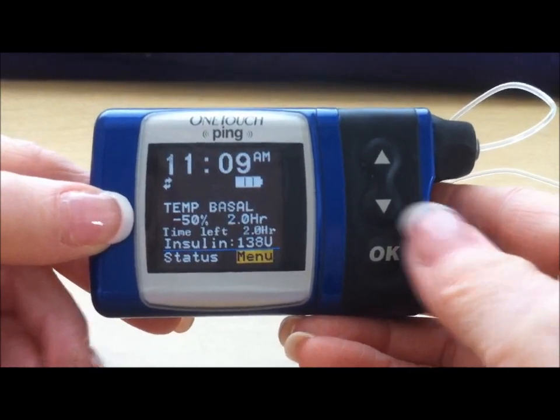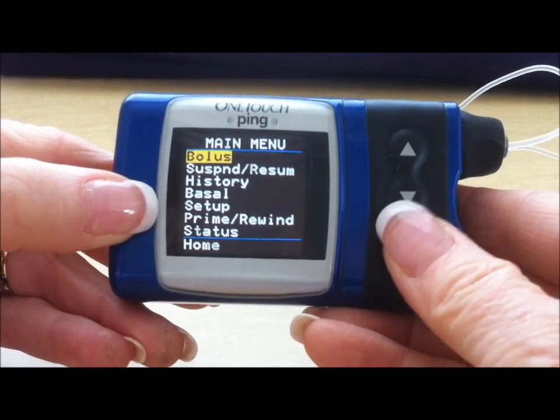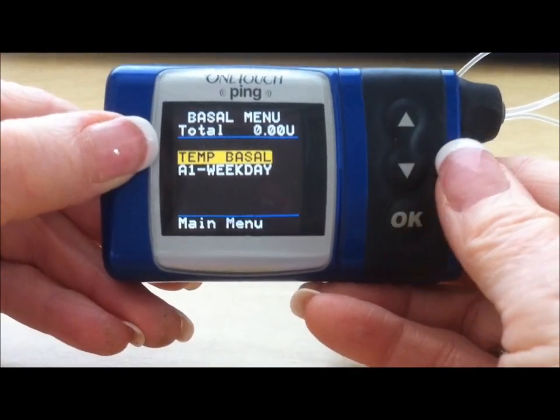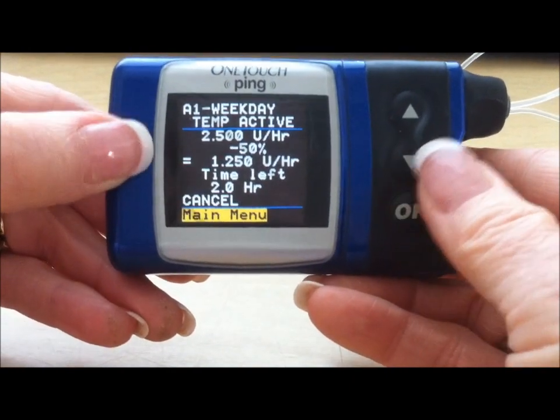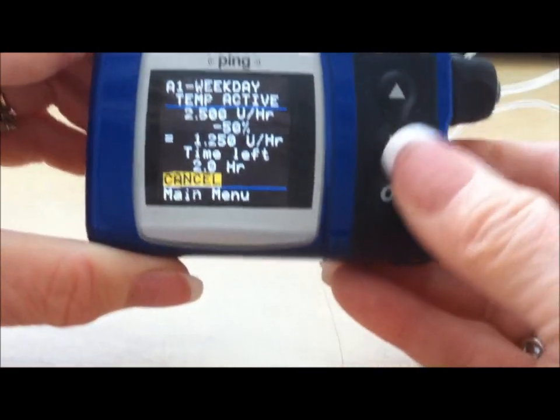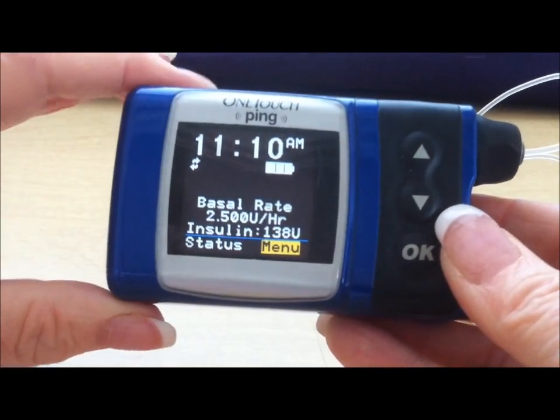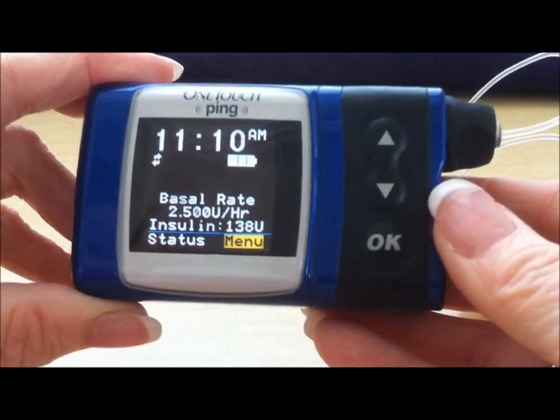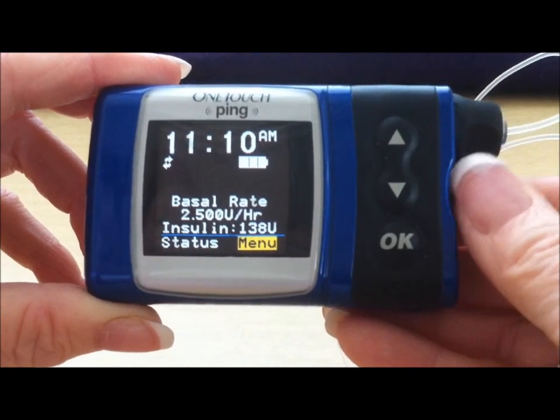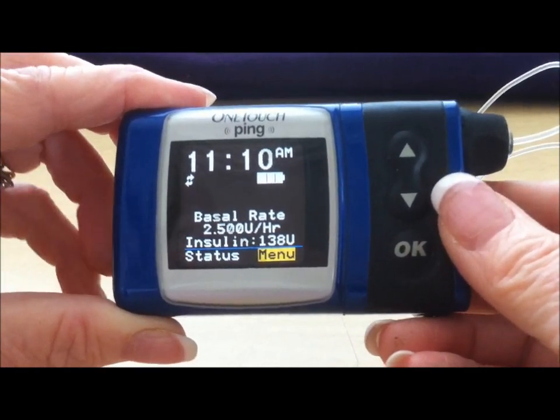If you have set a temporary basal rate for some anticipated exercise but end up not doing that, you can go ahead and cancel the basal rate. Go down to your basal option, press Enter. Temp Basal is in capitals because that's what's running right now — press Enter. You'll see that one line above the main menu is cancel, so use your up arrow to go to cancel. That reminder that the basal rate was operating is no longer there, and you're back to your usual 2.5 units per hour. This ends the brief explanation about basal rate adjustments and pump button features you can use on the Animus Ping. Any further discussion about pumps, settings, and rates should come from your health care provider.